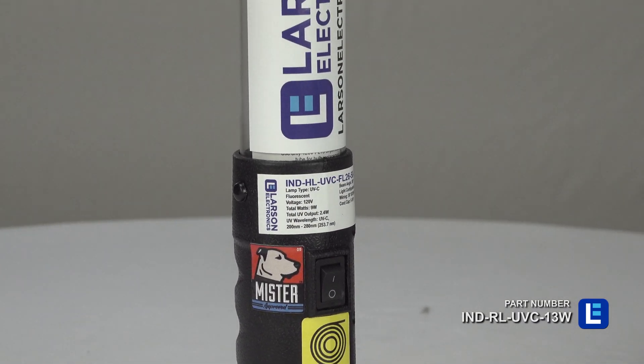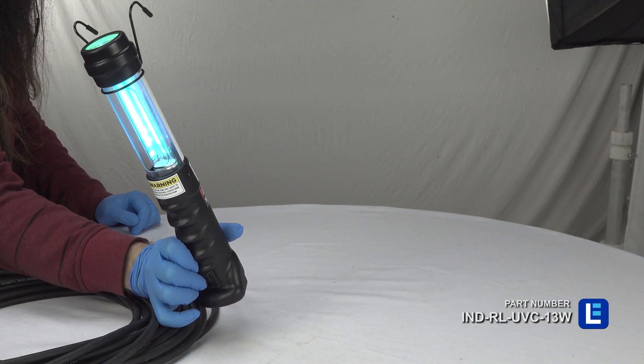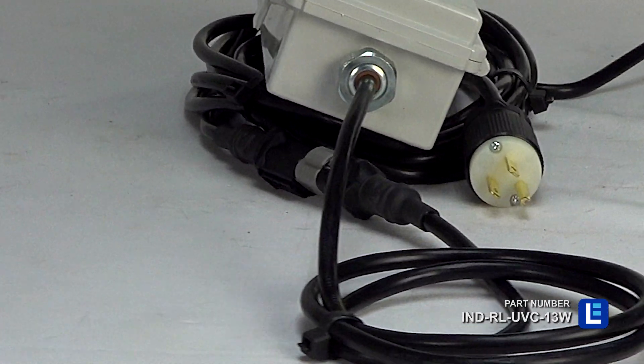This light has a 90-minute run time with a 24-hour charge time. It comes with a 515 general area plug and charges on 120 volts AC. It includes 25 feet of SOOW cable and a cord cap.